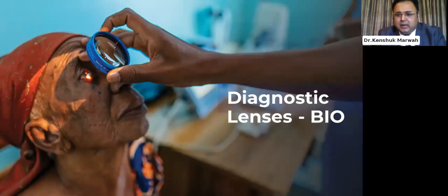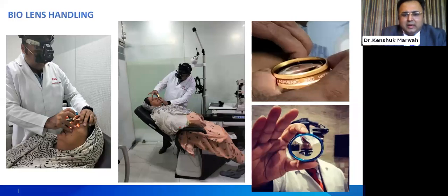Coming to the first part of the webinar, the diagnostic lenses. The first lens that we hold as ophthalmologists, and which is the most challenging part to learn during our residency, is the diagnostic BIO lens. Here are some photos of me doing a BIO lens examination. I would give one very good tip to beginners: anybody can start using a BIO lens, as the indirect ophthalmoscope is now easily available.